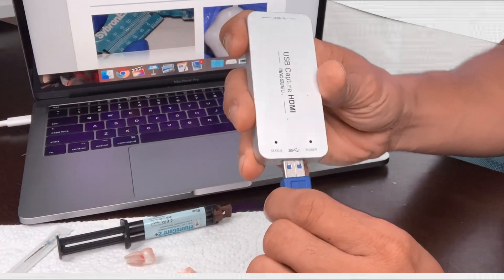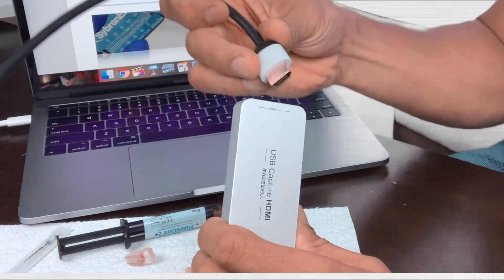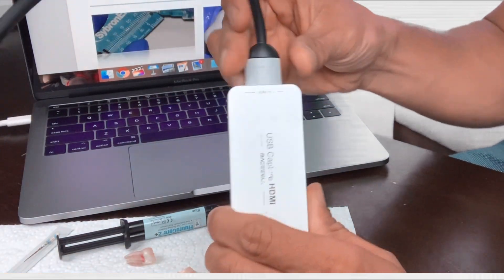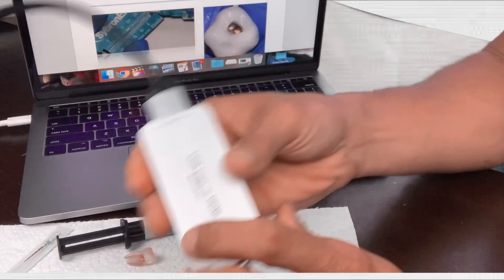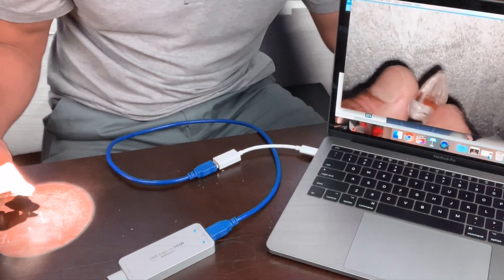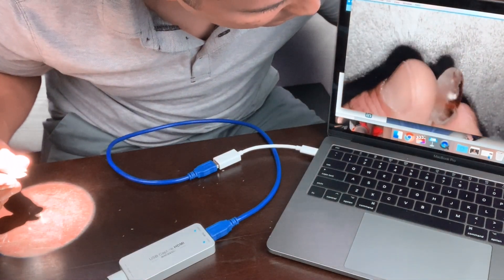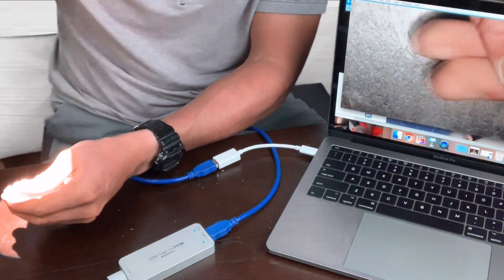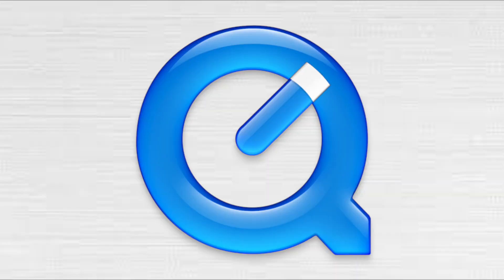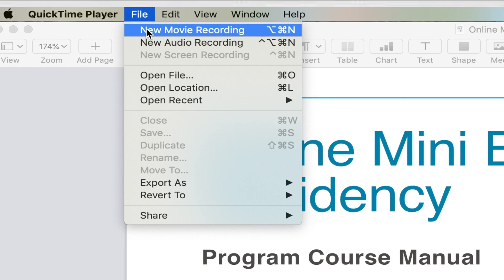With the video camera connected to the scope, it's time to connect to my MacBook. I use the Magewell capture device, which connects through USB. After connecting my HDMI cable, I get two blue lights and we're good to go. The feed through my MacBook is instant — incredible. I use the built-in QuickTime Player to view through the screen and also to capture the video. It's super simple to use QuickTime Player to record the video feed.